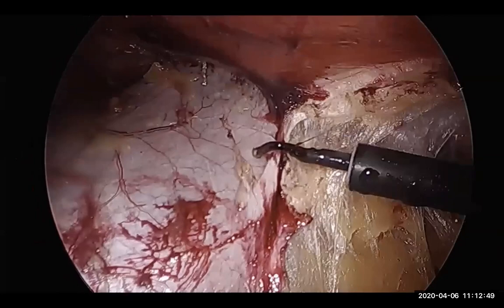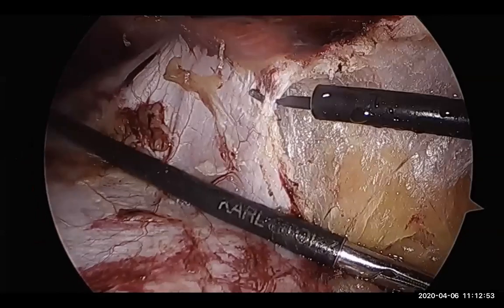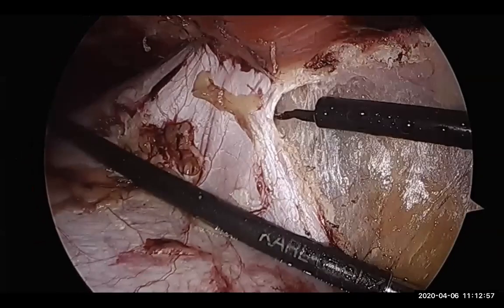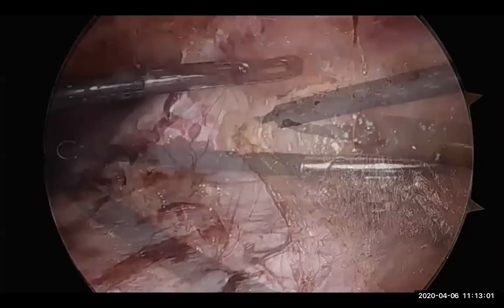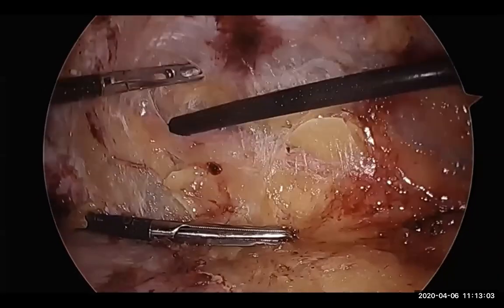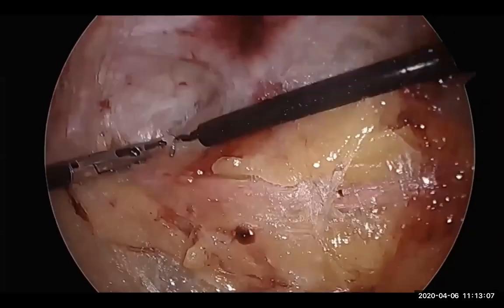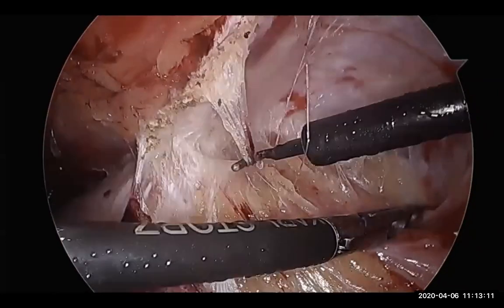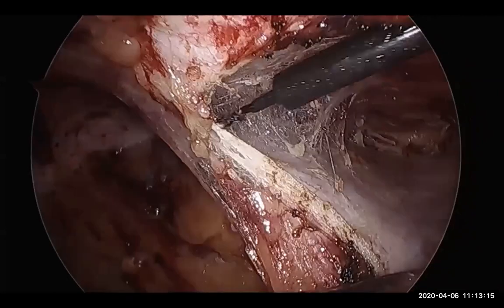So what happens is, when you keep doing this on either side, divide the PRS a bit on the right, then push down the central fatty falciform and the peritoneum, and then divide it on the other side. You keep pushing down all the peritoneal contents with an intact layer of peritoneum and fascia transversalis, and expose the linea alba at the top of the screen.